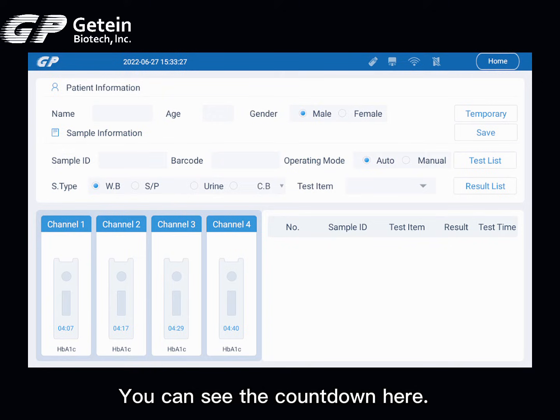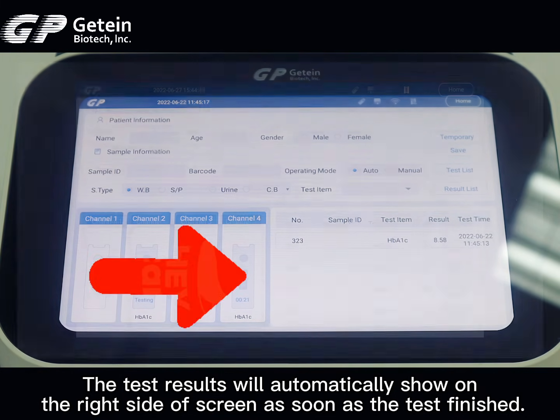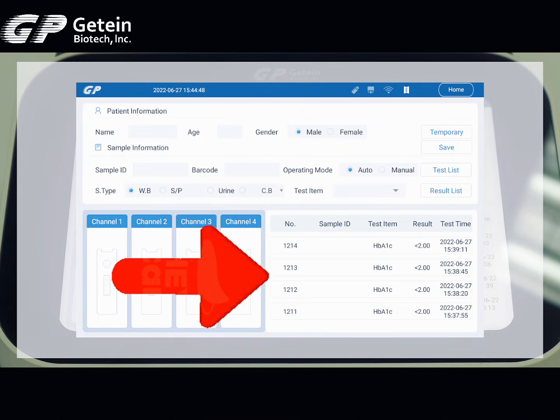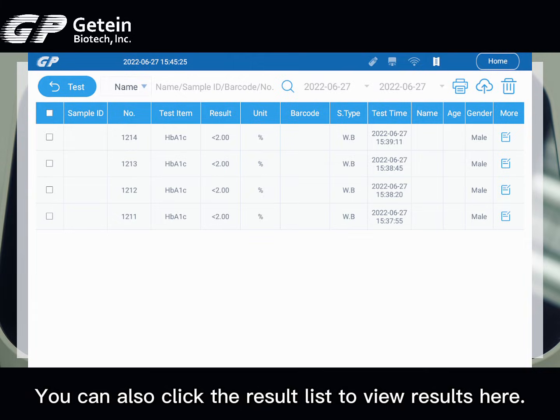You can see the countdown on screen. The test results will be automatically shown on the right side of the screen as soon as the test is finished. You can also click the result list to view the result.